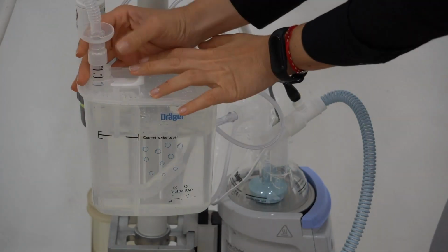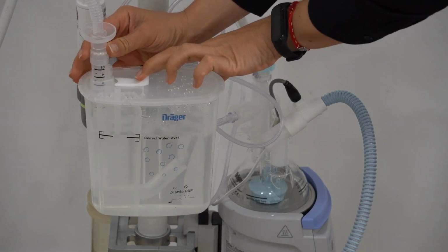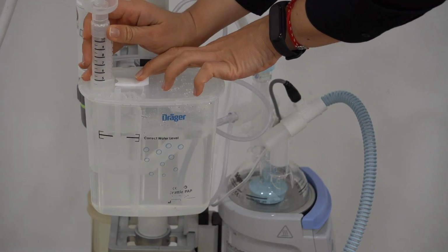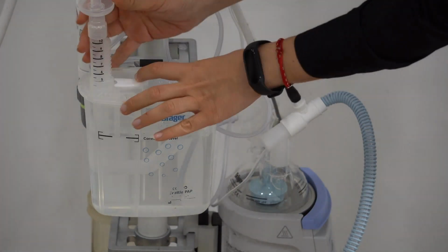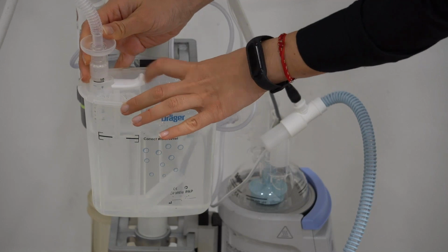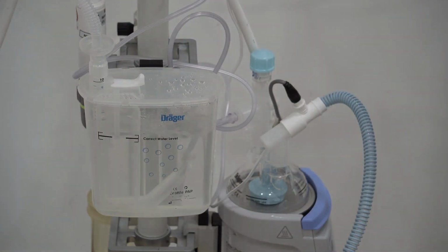So in order to change the CPAP level, we can move the safety valve, and then we can reduce the CPAP, and you already see that the bubble oscillation is a bit less, or we can increase the CPAP to the maximum, and we see that the bubbling is now more vigorous.